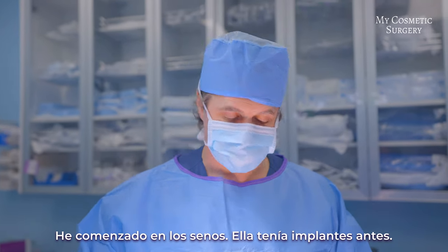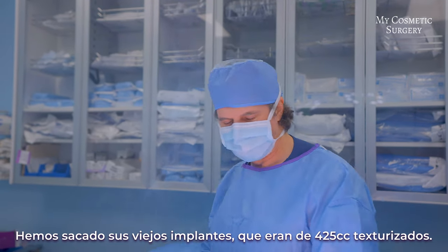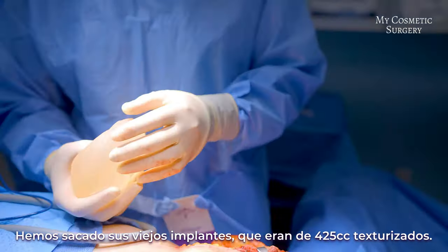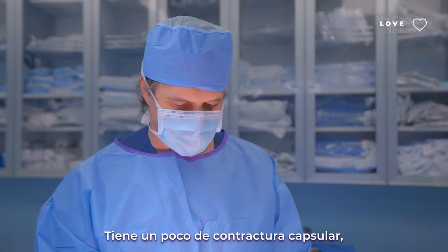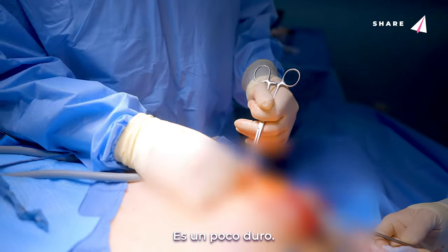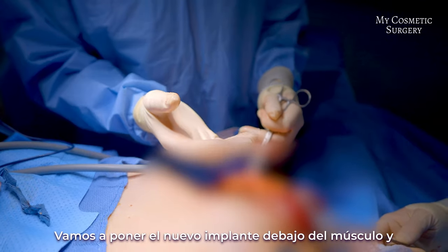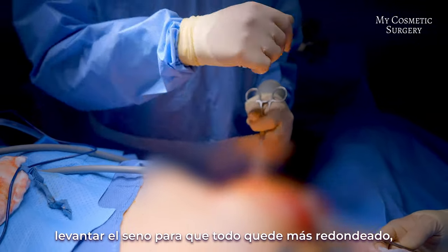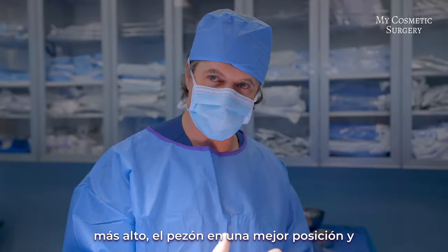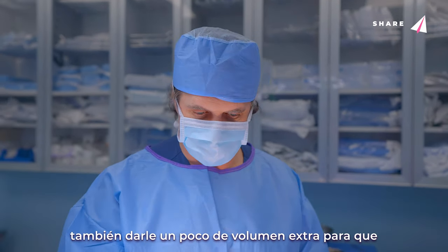I've started on the breast. She had implants beforehand and we've taken out her old implants, which were a textured 425. She has a little bit of capsular contracture — you can see this is the capsule around the old implant, it's a little hard — so we're going to cut that out so everything is fresh and new. We're going to put the new implant in under the muscle and then lift the breast to get a more rounded, better shape, higher position, the nipple in a better position, and a little extra volume so she can be symmetric.